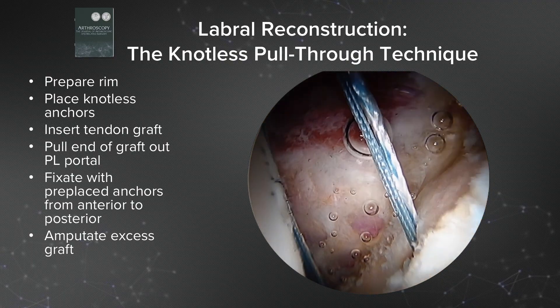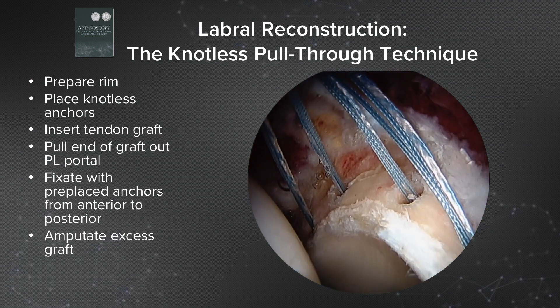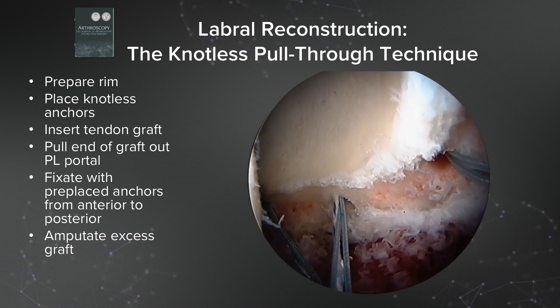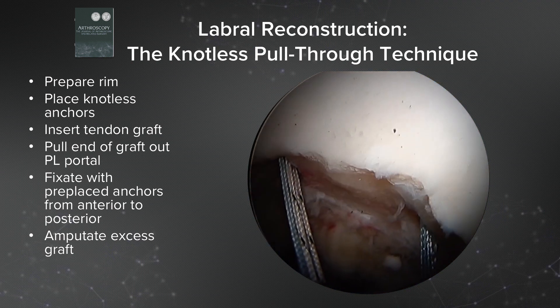Next, we place the knotless suture tack anchors all the way around the rim. These are placed circumferentially, spaced about 6 millimeters apart. Here we are posteriorly, and there we are anteriorly.